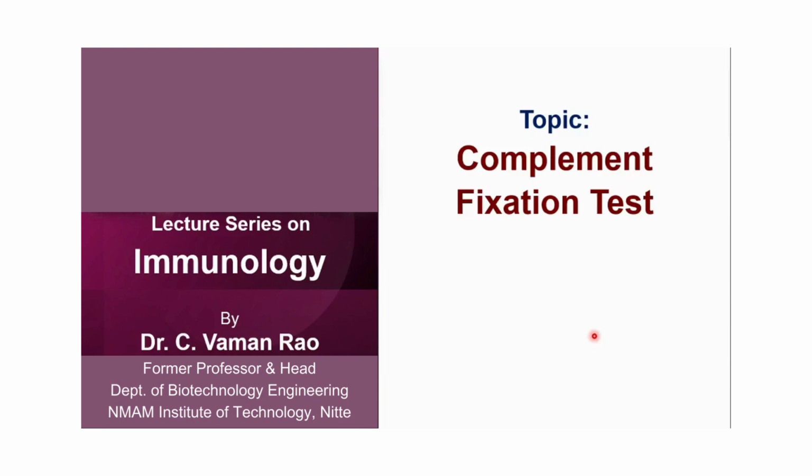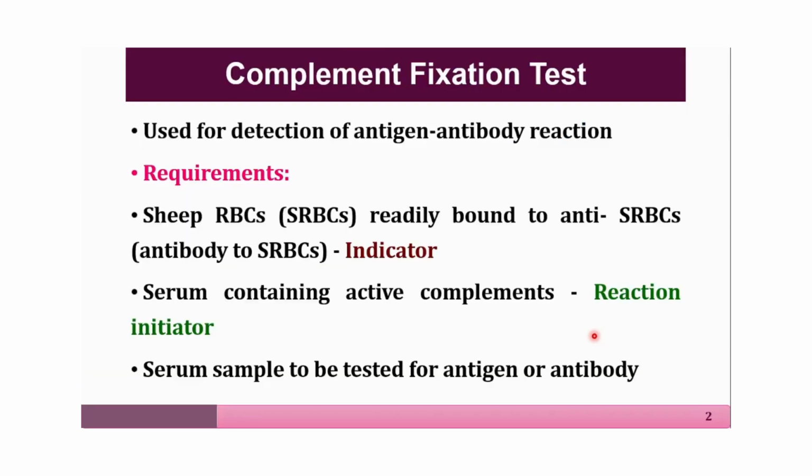I'm going to talk about complement fixation test. This is another type of test to prove the antigen-antibody reaction. And here you require sheep RBCs readily bound to anti-sheep RBCs.